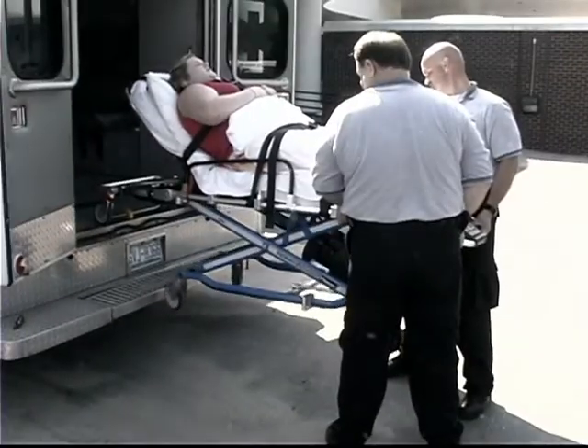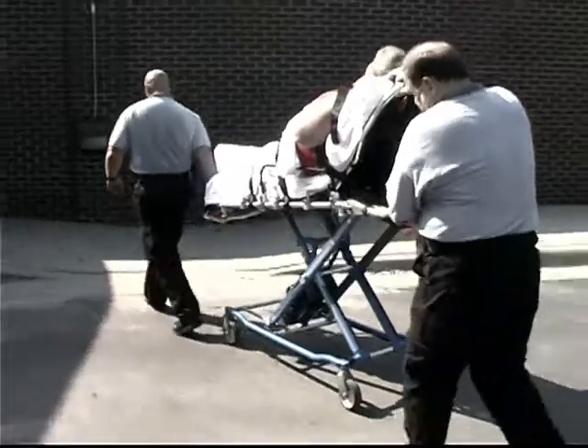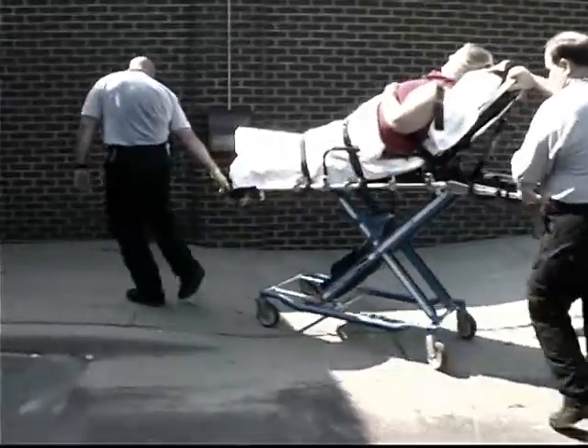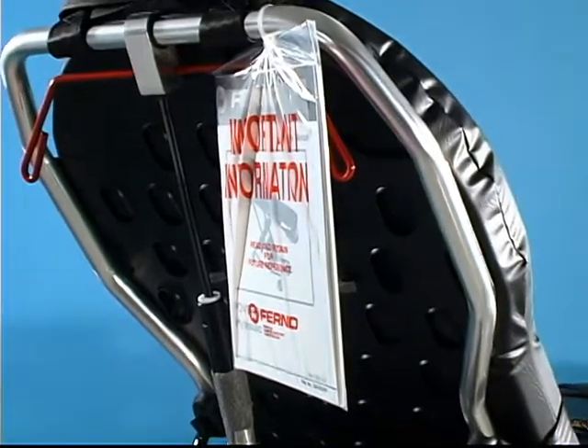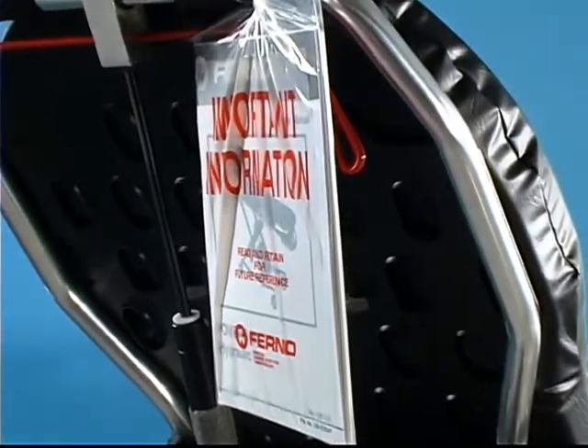Getting started is easy. This video provides a quick start guide for your new PowerFlex powered cot. Please refer to the manual included with your new PowerFlex for detailed guidelines and usage instructions.